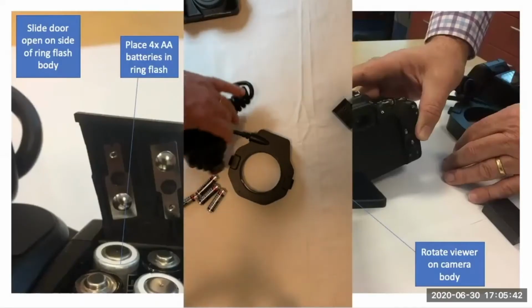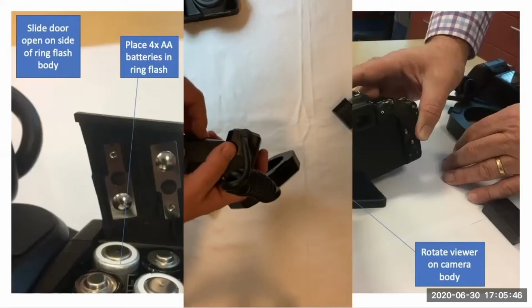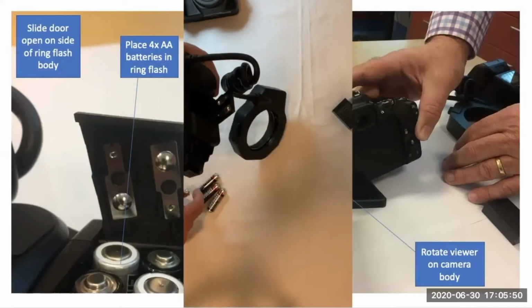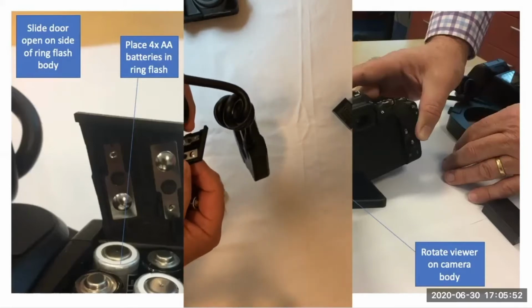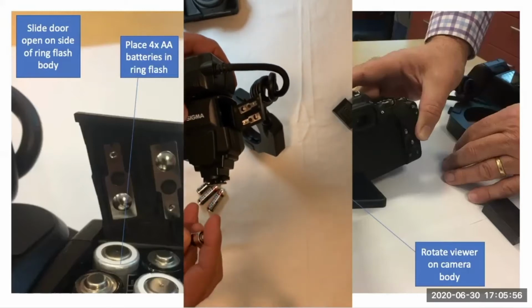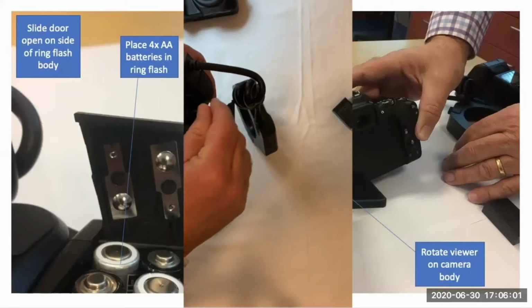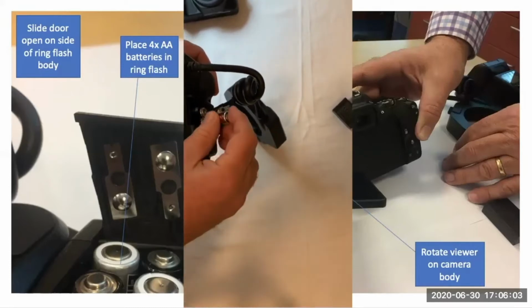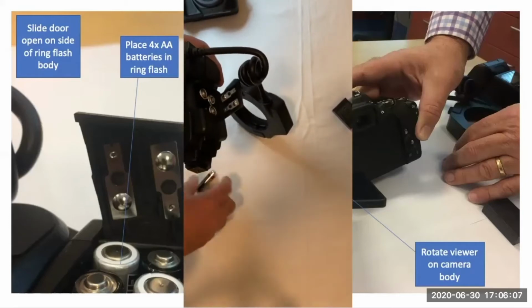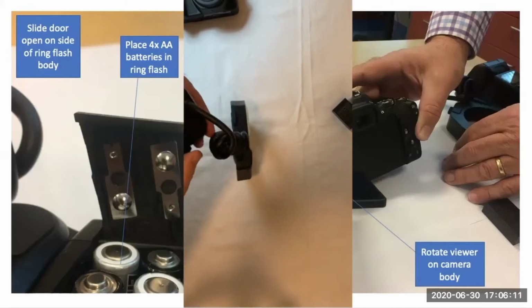So the first thing to do is to put some energy into the ring flash. There are little instructions right down there. Of course, they write it in black on black, of how to put these things in, but hopefully you'll be able to see there's a particular order that the ring flash needs to have its batteries in. Once in there, these batteries will tend to last a little while.